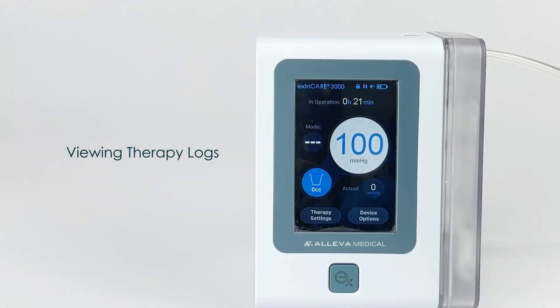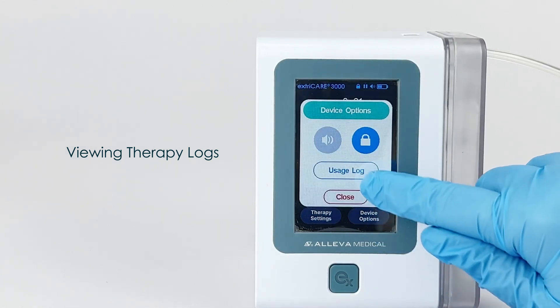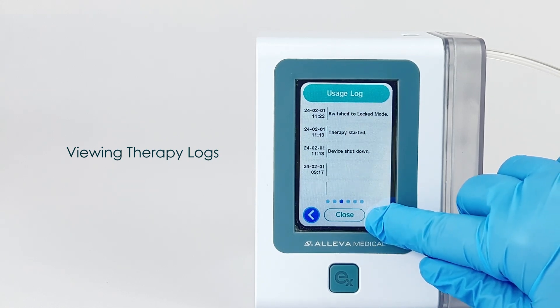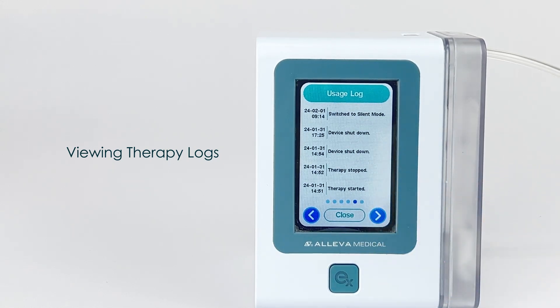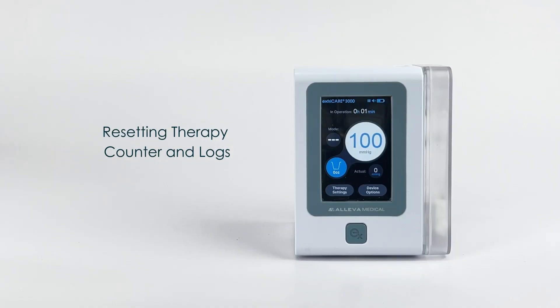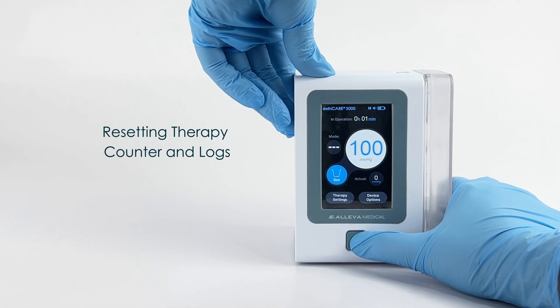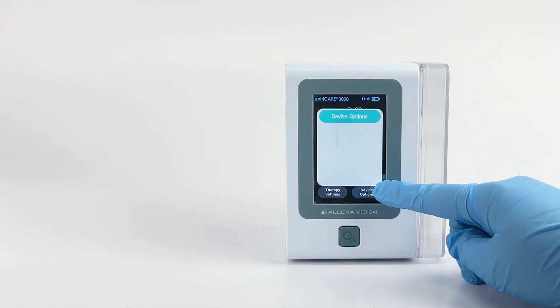Usage Log. The extriCARE 3000 has the ability to log the date and time of important events during therapy. Examples of such events include when therapy is paused, when an alarm occurs, when therapy is resumed, and when therapy settings are changed. You can view those logs by pressing the device options button on the main page and then pressing the blue outlined usage log button. The unit will display the last 30 events, 6 events per page, starting with the most recent. You can scroll through different pages by pressing the blue arrow buttons. To clear the usage counter and event log for a new therapy or patient, press down on the power button and the EX button at the same time for 3 seconds. The usage counter will reset to 0 and the event log page will be cleared.